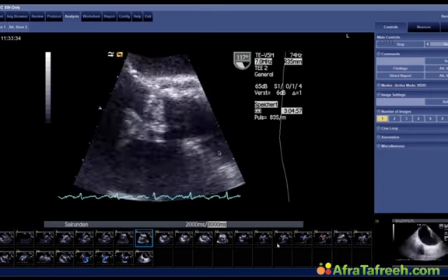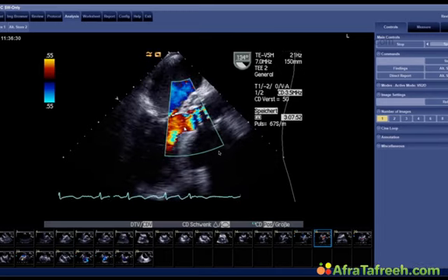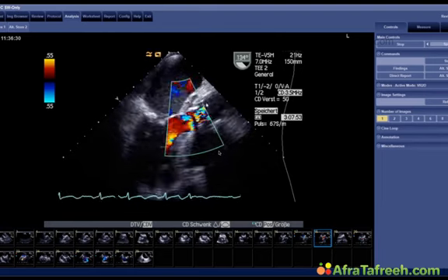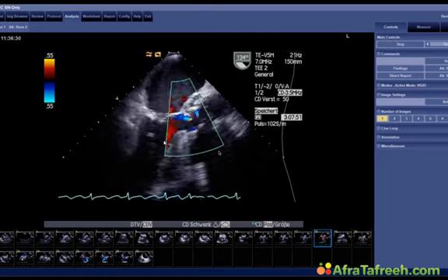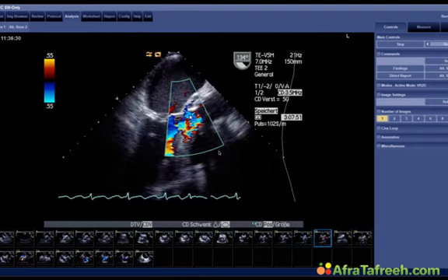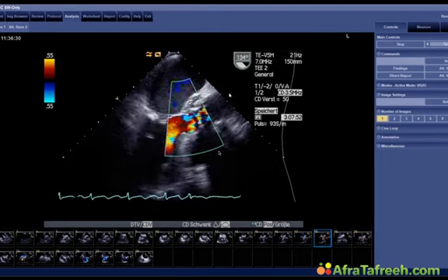And then what happens is that we have flow into this region. You can see this very nicely here. We have flow that goes into this region and back out. And there most likely is what you can almost call a fistula between the ascending aorta and the LVOT. So there's blood flow which goes here and probably back in here and then back out again. And then there's also flow from this cavity, from the pseudoaneurysm, back into the LVOT.